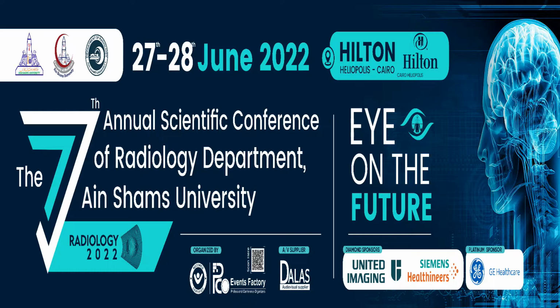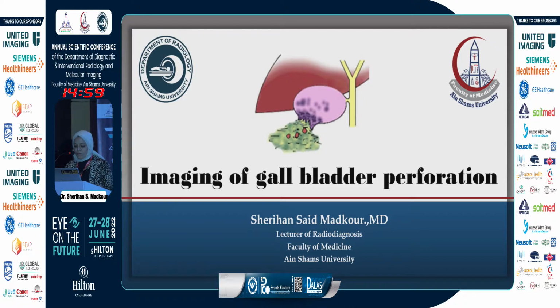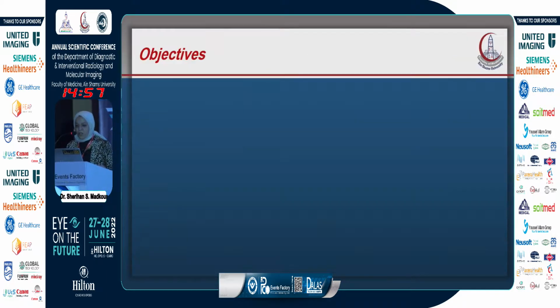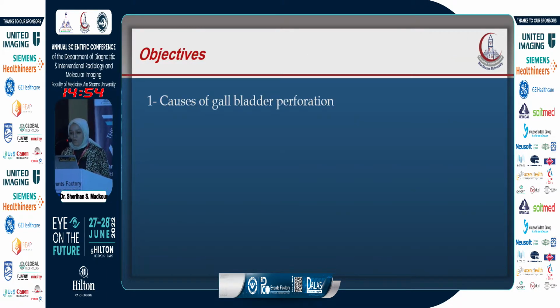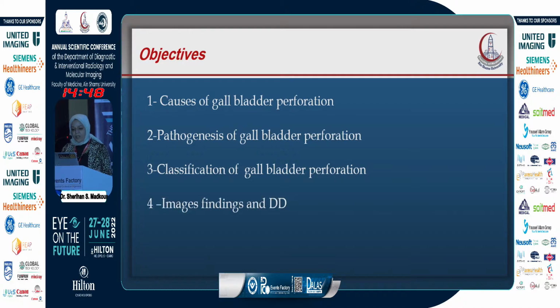Good morning, Professor and colleagues. Today we will speak about imaging of gallbladder perforation. Objectives: causes of gallbladder perforation, pathogenesis of gallbladder perforation, classification, imaging findings and differential diagnosis.